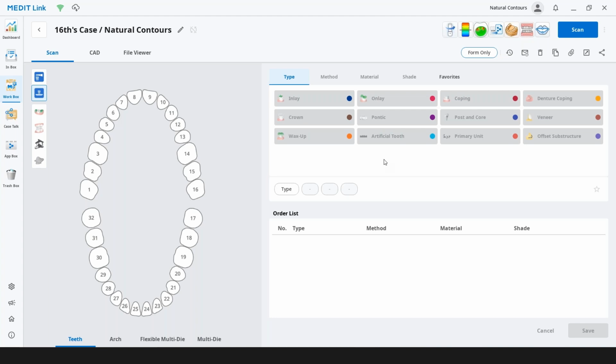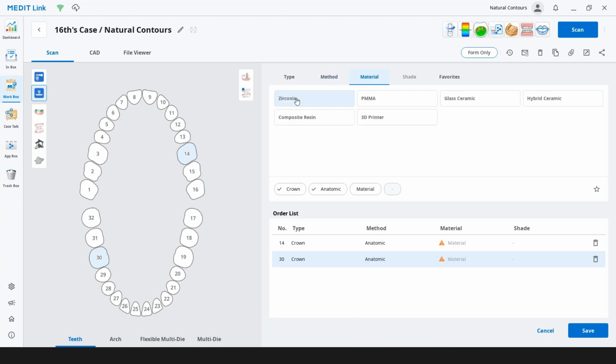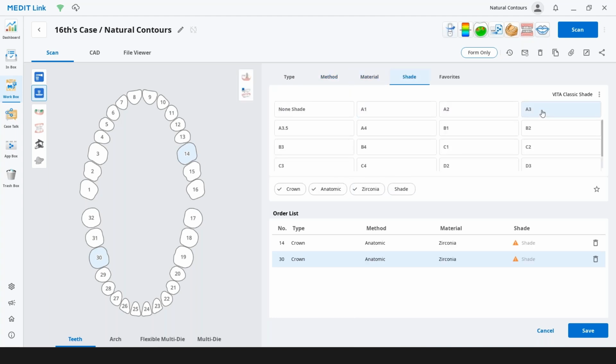Okay, so we can go into the diagram here. When you're setting up a crown and bridge, you want to use the teeth. And if you're using dentures, partial dentures and clear aligners, you're going to be selecting arches. So we're using teeth here, and you select your tooth number that you work on, whether the die. And if you have more than one, you can hit the control key and do them both at the same time. That way you don't have to set them up here and make your choices twice. So I'll do crown, anatomic, zirconia, A3.